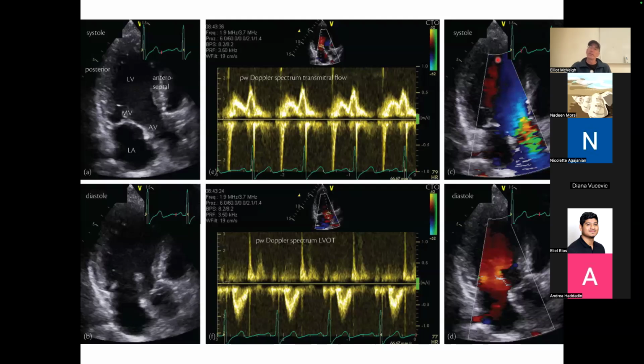And so you can see that in the left ventricle itself, one half of the ventricle, the blood is sort of swirling down this way. And then as it's being ejected, it shoots up this way out the aorta, right? And so we have a high velocity. That's this green signal here. And in fact, we have some red and yellow because there's probably some kind of swirling and random direction to the velocity there as it's coming out. So that's during ejection.